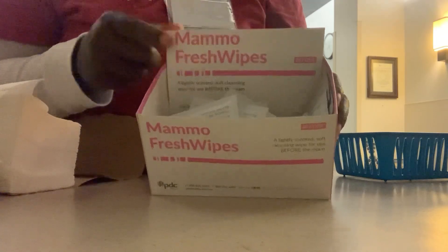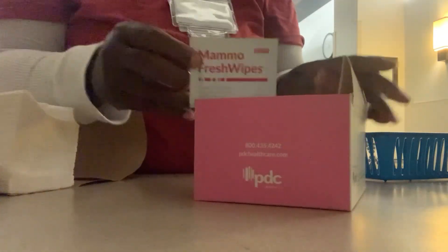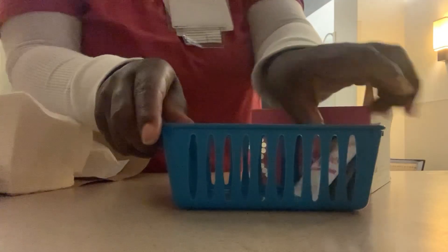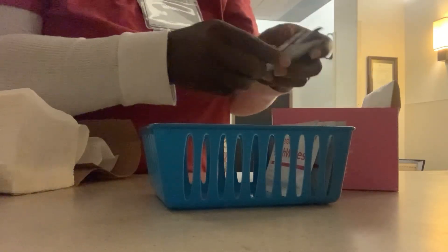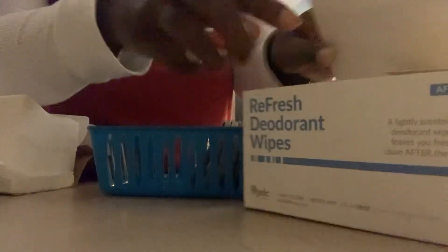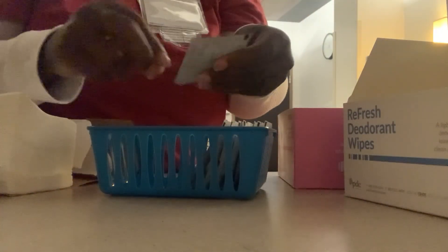I'm stocking the room and making sure that we have fresh wipes to remove deodorant for each patient. Sometimes patients have deodorant on, but it has to be removed for the mammography exam so that they do not get a callback — deodorant can look like there is something in their breast. I'm also stocking the deodorant wipes that the patient can use to refresh after the mammogram.